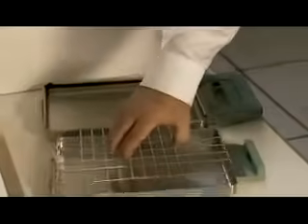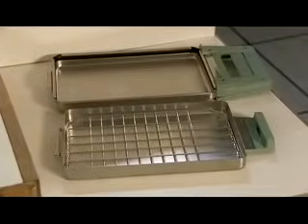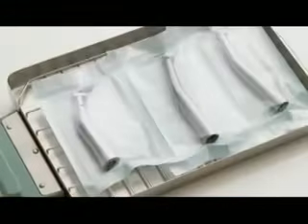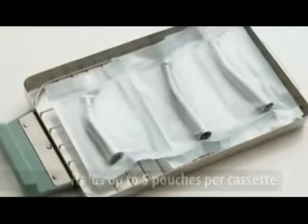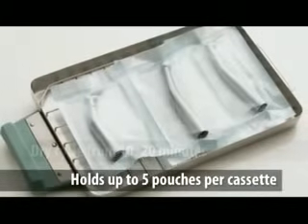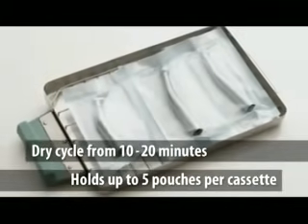Statum leads the market in gentle sterilization of instruments. For wrapped loads in pouches or bags, simply place the rack so the feet are facing down as shown. This allows better air circulation around the wrapped packages. Wrapped loads in the 2000 can hold up to 5 pouches per cassette. The dry cycle for wrapped pouches takes from 10 to 20 minutes.